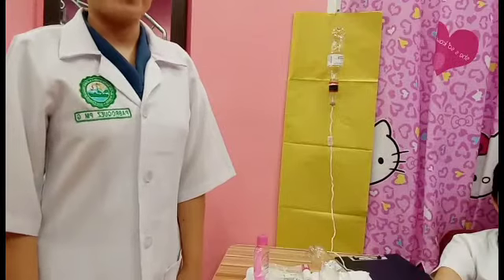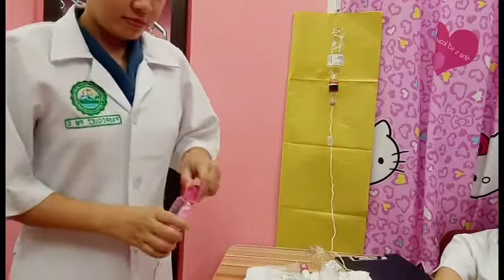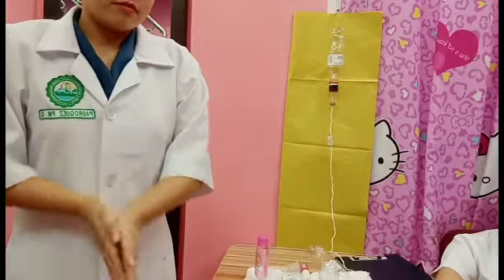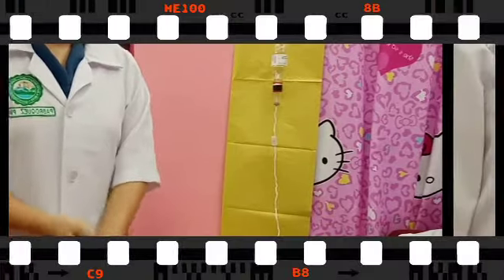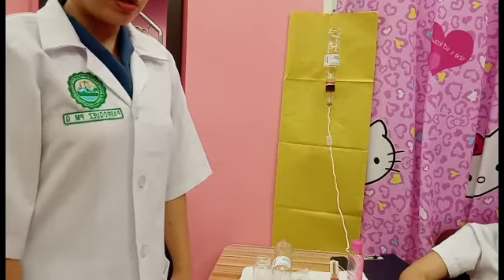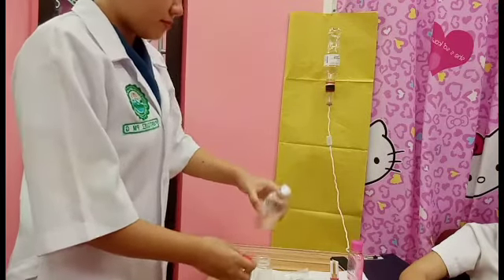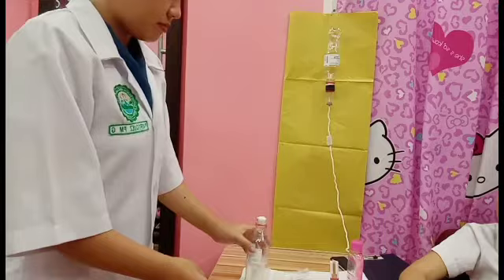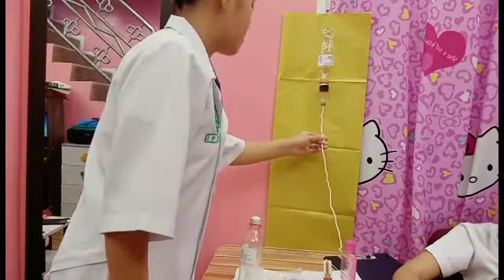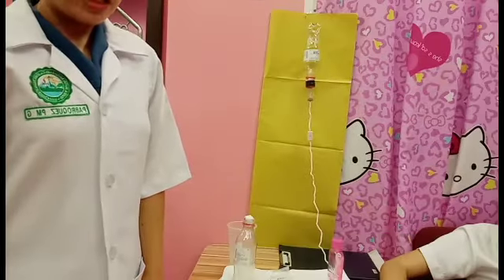So next is to wash your hands to avoid passing of microorganisms from one another. So to change IV solution, we need to carefully remove protective cover from the new solution container and expose the entry side. Then, close clamp for tubing. And then, leave container of IV pole and invert it.